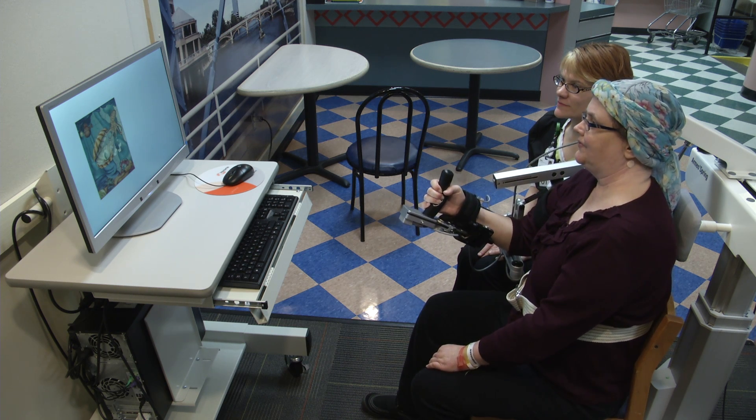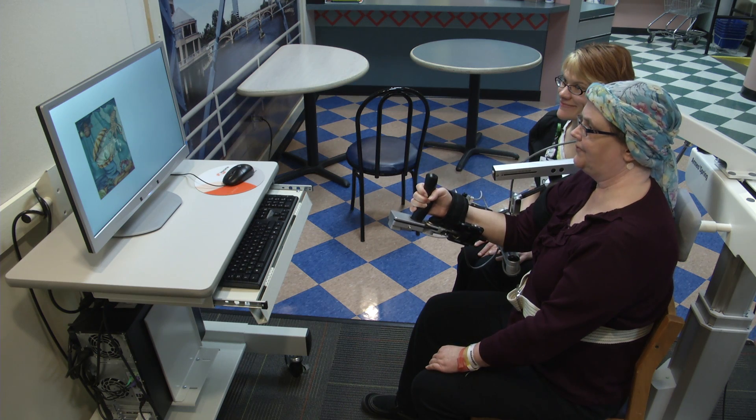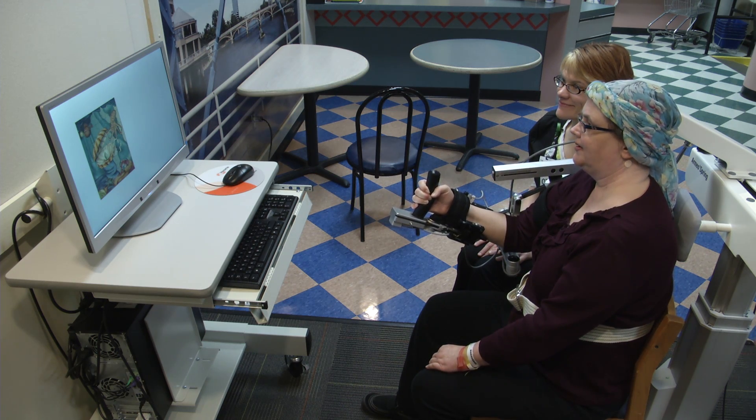So this kind of machine is just one of our tools that we can use, and a lot of patients find it challenging and fun.